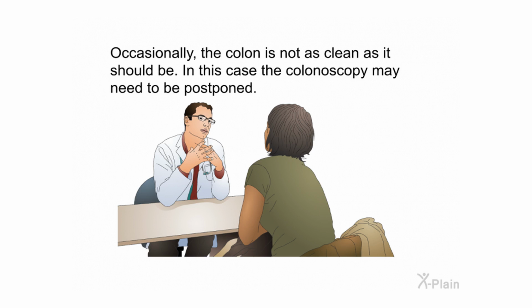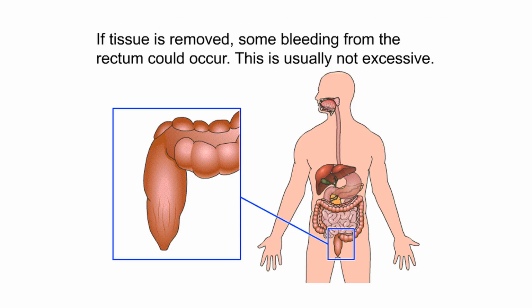Occasionally, the colon is not as clean as it should be. In this case, the colonoscopy may need to be postponed. If tissue is removed, some bleeding from the rectum could occur. This is usually not excessive.